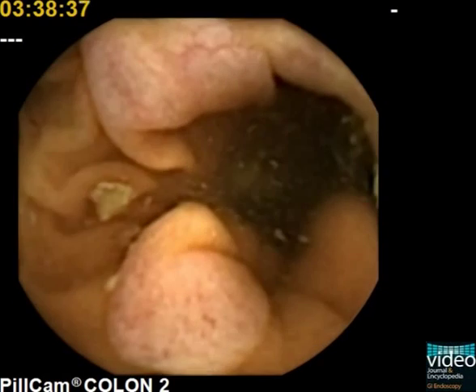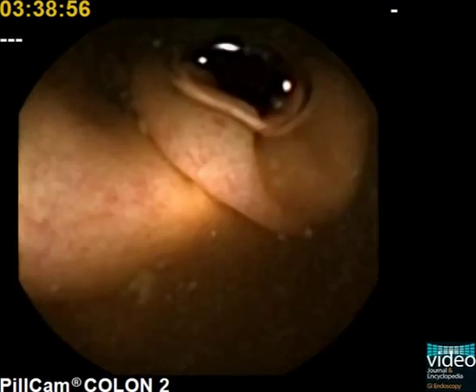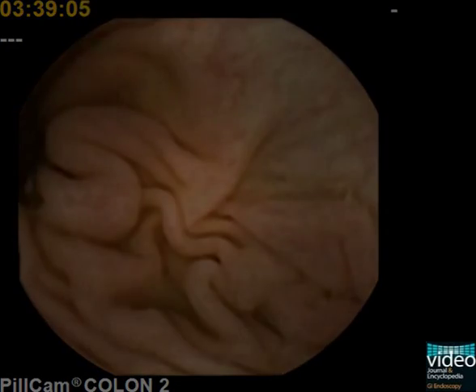The valve of Bauhin, apparent at about 8 o'clock in this video, should not be mistaken for a polyp.